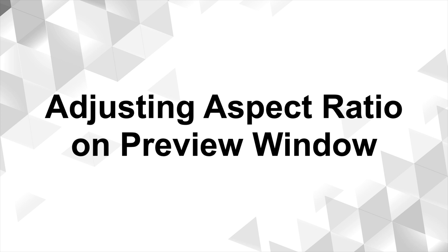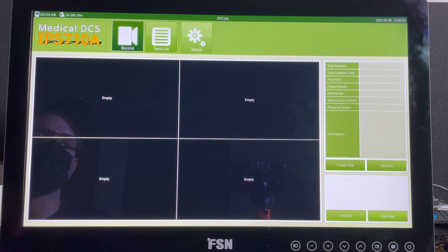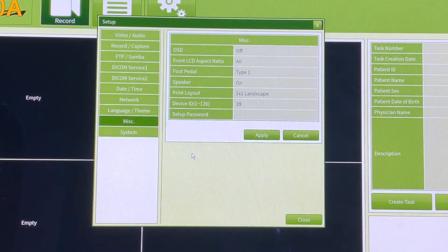To adjust the front panel's aspect ratio, utilize the external monitor controls. Click on Setup and enter the password. On the left, choose Miscellaneous. On the right, click Front LCD Aspect Ratio. We are choosing Fit Vertical. Click Apply and then click Close.